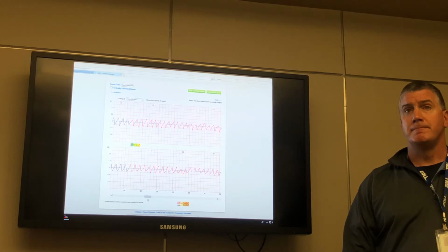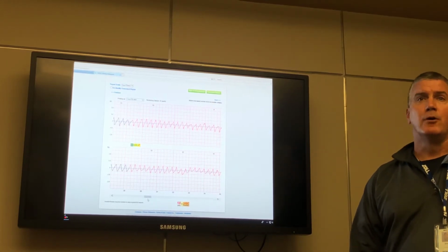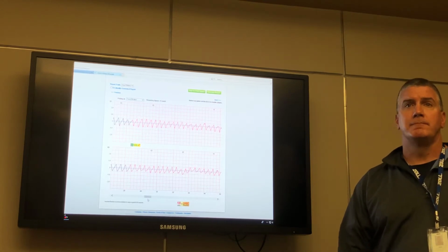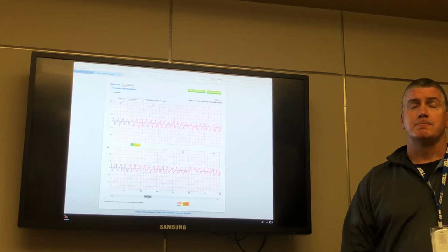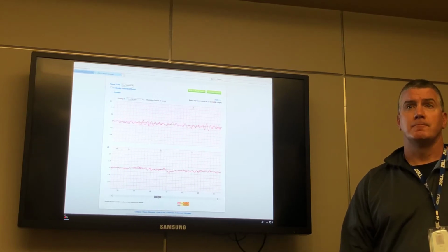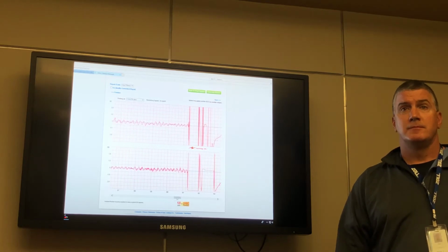And just de-identify it and send it to you so that you can view it and get it immediately. So we're always real conscious about making sure we're not breaking HIPAA laws and stuff like that. Because this is very useful for the nursing staff too, for patients who said, you know, I've been feeling terrible, whatever, they could potentially do this if it hasn't been done.